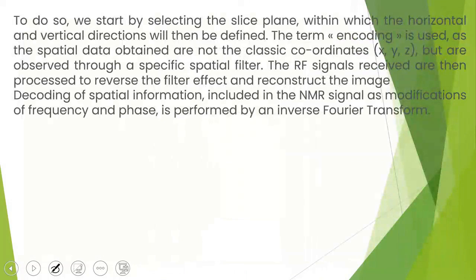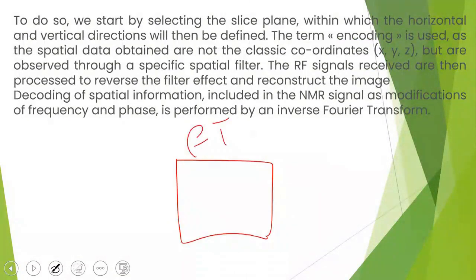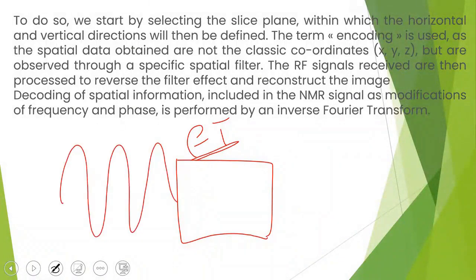The one who created this concept is the great scientist Fourier. Fourier developed something called Fourier transformation. He said, now I have a signal in this form. This signal can be transformed from what I call the time domain. The time domain means it is coming in the space of time or at a specific moment. I can transform it into something called the frequency domain.